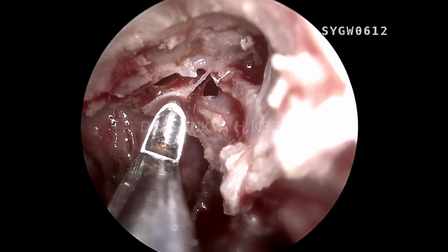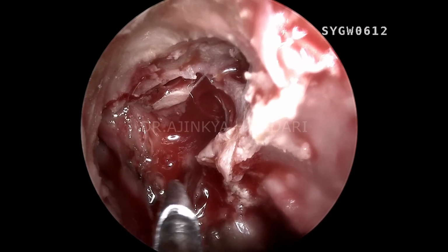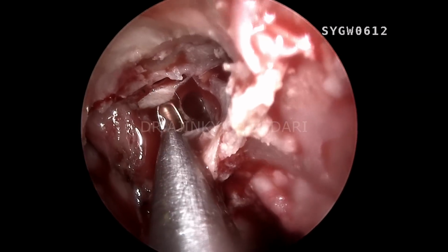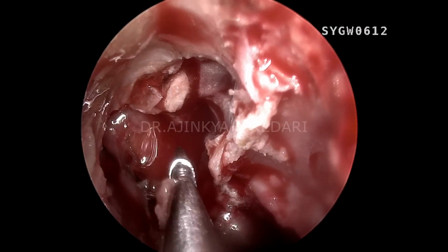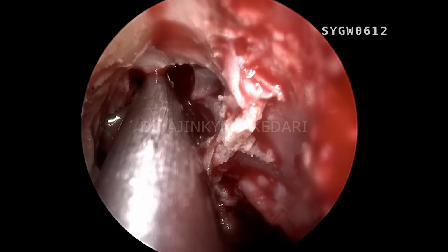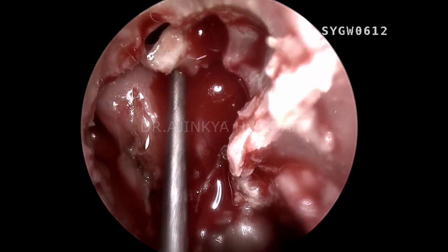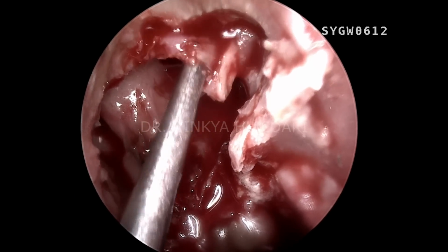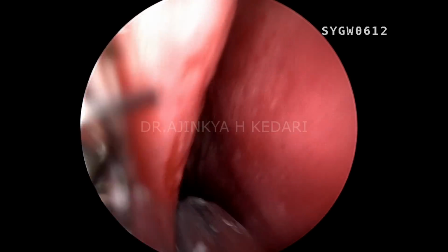Once I drill that, you can see I'm using a bone punch again after I have made it bony thin, eggshell thin. That's the mucosa attached with it. You can see now that is probably the fractured bony segment from the previous traumatic experience, as well as from the transcranial route this patient was approached by. So this could be the fractured bony segments towards the roof of the frontal sinus. You can see I've taken away that septation, probably a fractured bony segment.